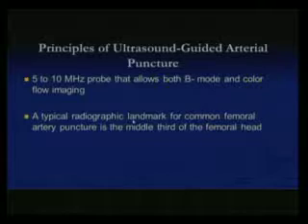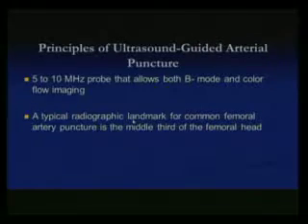Once you've got the patient sedated, or whatever anesthesia we're using, you've already talked to the tech about your plan and how you're going to handle it. You already have your lead and your contrast, looking at the creatinine, whether you're going to use half strength or full strength. Then the patient is prepped on the table for you, and the most important thing is how and where we're going to do the access.